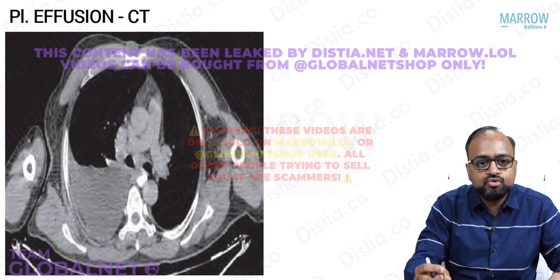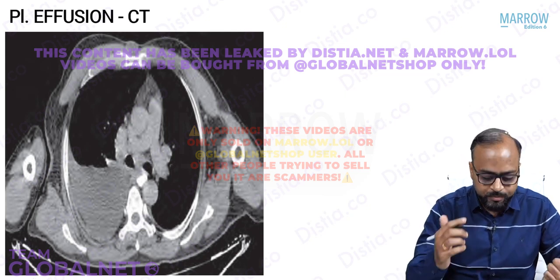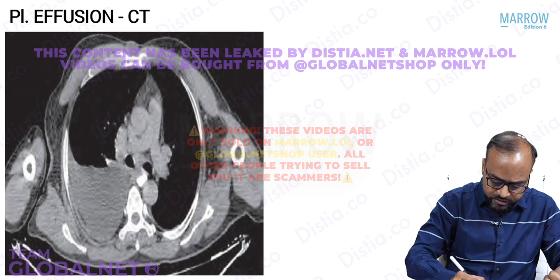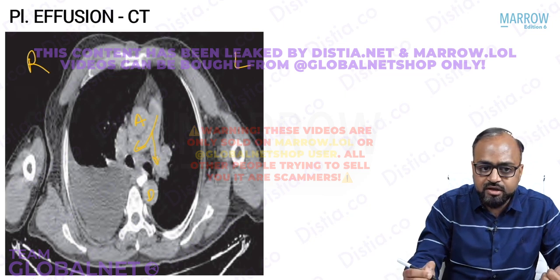How does effusion usually appear? Again, on CT, see if it is a free fluid within the pleural cavity, it will settle down to the dependent part. So see here, this is a CT image here. Here, if you see in this CT image, we know this is always right, this is left. See, these are the ascending aorta, this is the descending aorta, this is the main pulmonary artery which is dividing into the right and the left.